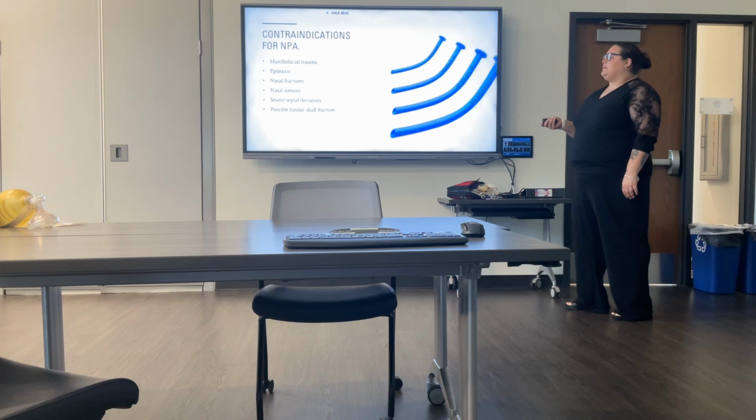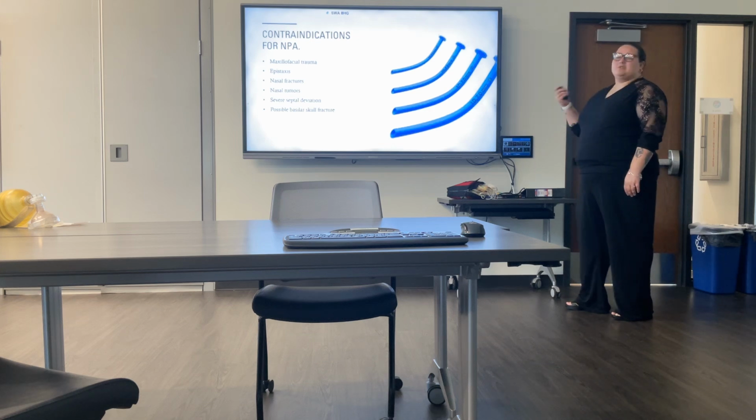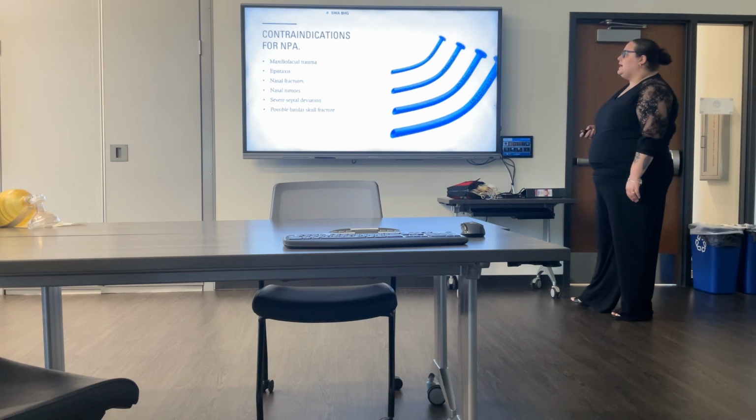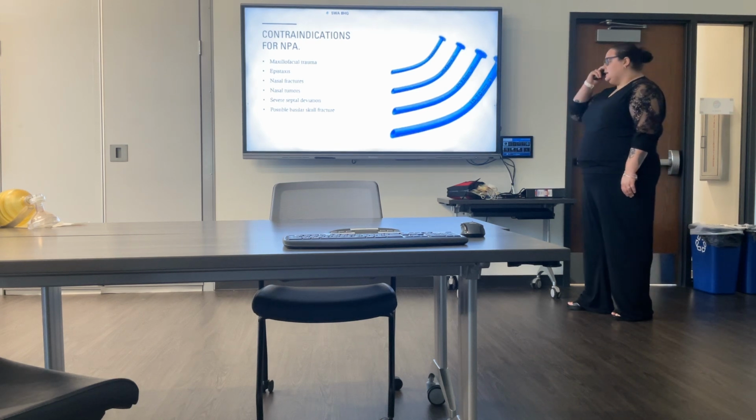If they have any kind of epistaxis, nose bleeding, if we go ahead and facilitate an NPA, we're going to cause more trauma as we're placing the NPA and cause more bleeding. So we do not want to put it in a patient with a nosebleed.